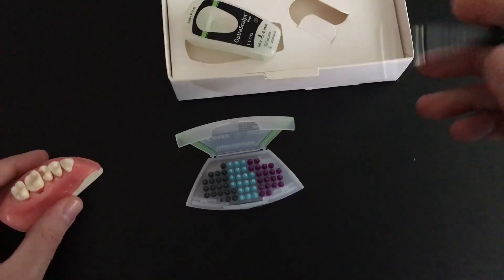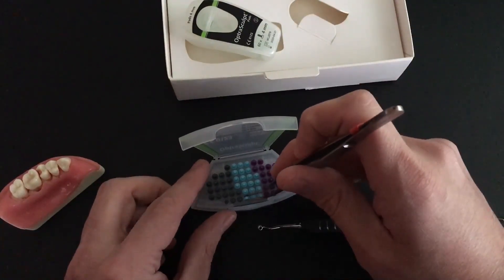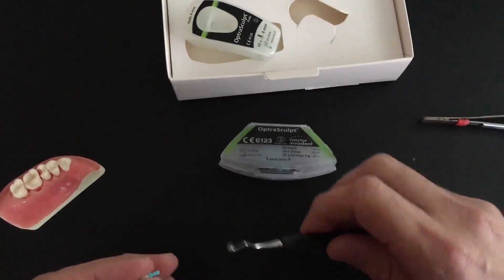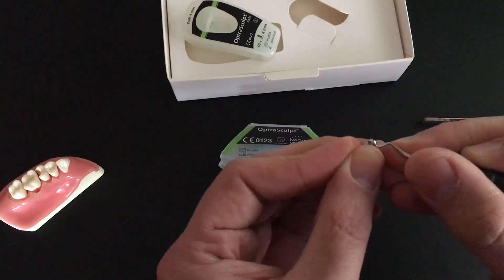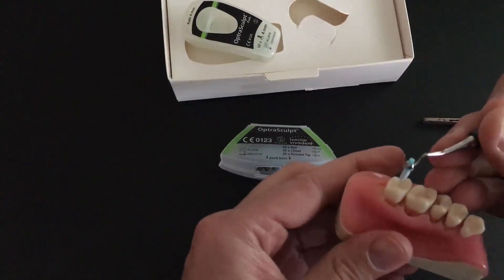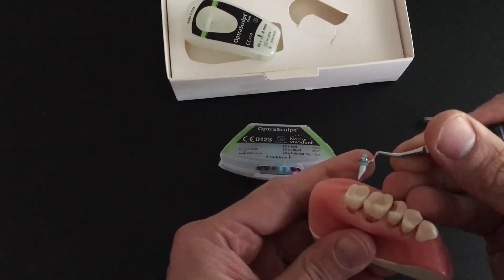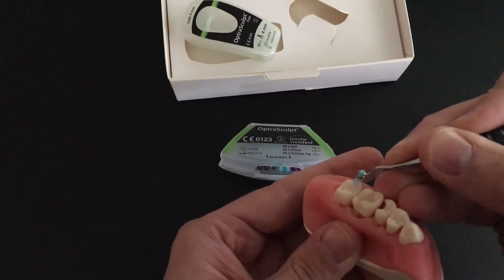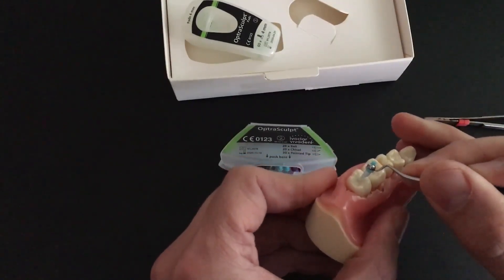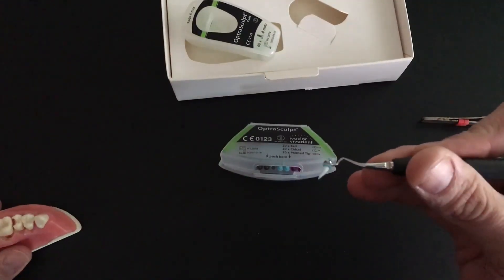You've actually got two ends you could use here, so you could put one of the other attachments on the other end if you wanted. This next one is called the chisel. You just pop it on just like the other one, and it looks — surprise, surprise — like a chisel. You can really see how that chisel could help you in carving inclined planes and putting sharper anatomy in, maybe after you use that ball to pack composite in there, to mimic the occlusal anatomy we see on posterior teeth.